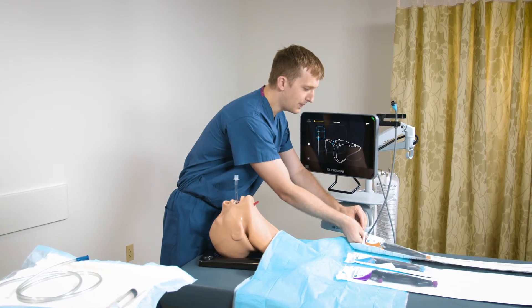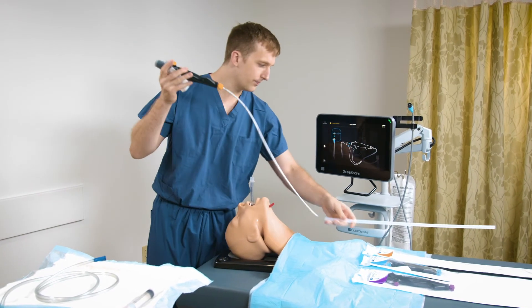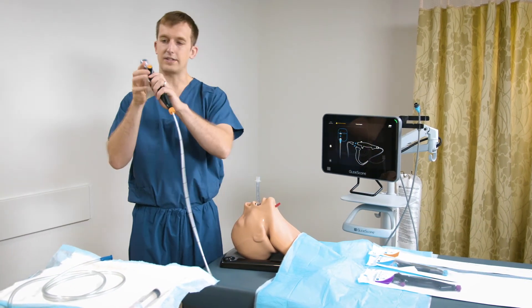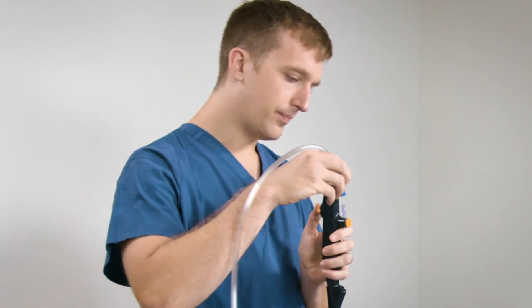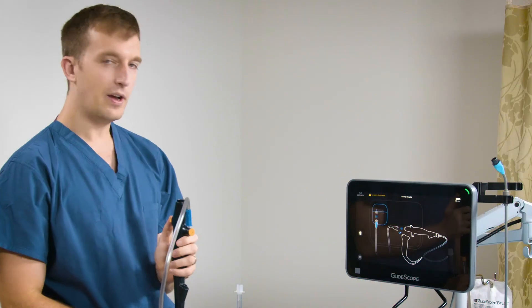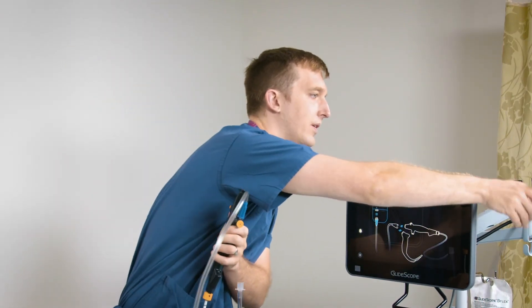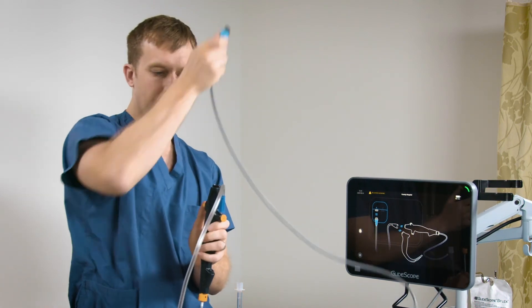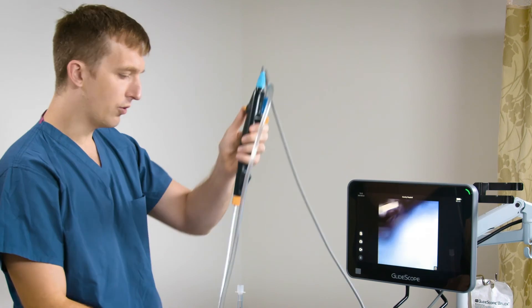Removing the bronchoscope from its packaging, I next removed the plastic insertion tube cover and the plastic cover for the handle. I'm now ready to hook suction tubing up to the suction port of my bronchoscope. I'm now ready to connect my bronchoscope to the monitor using the quick connect cable with its magnetic mechanism. I'm now ready to perform my procedure.